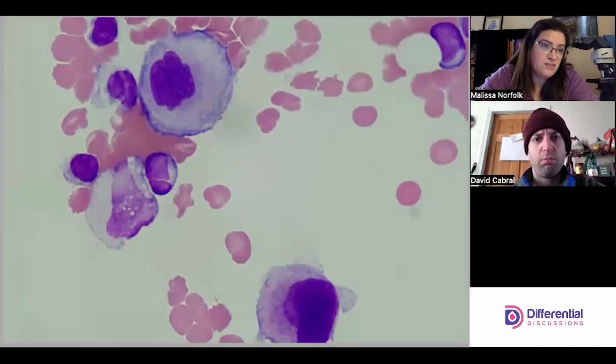Okay, well, I think we've seen a good amount of these ugly malignant looking cells.